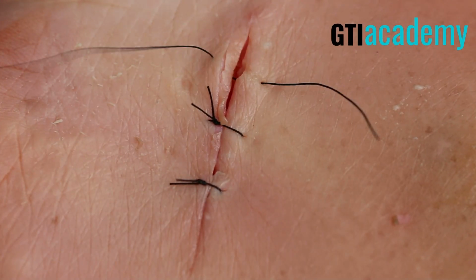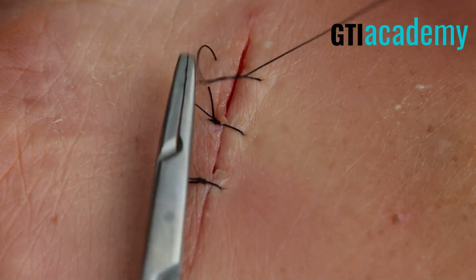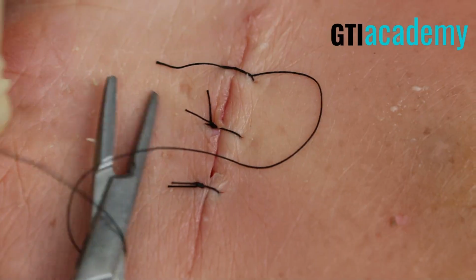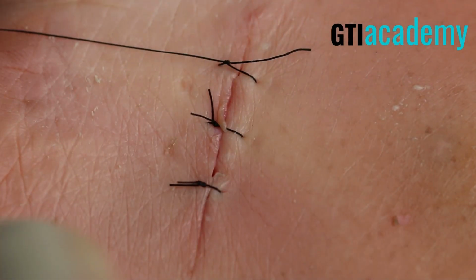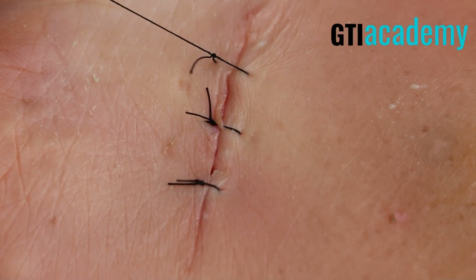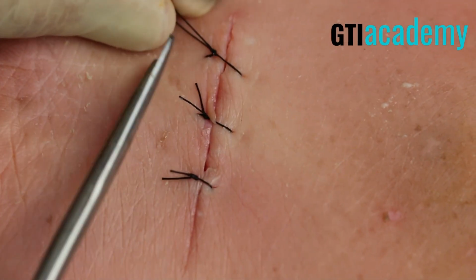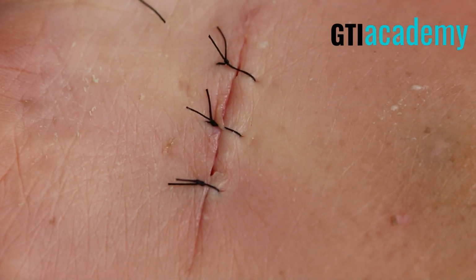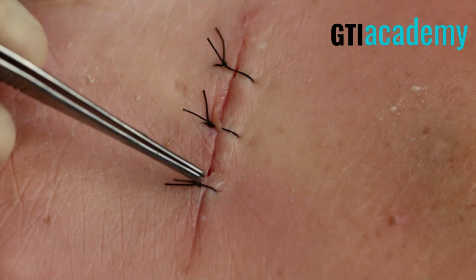Driving, completing the circle. There we go. A suture knot will follow in the surgeon's knot twice here. Then we'll go once and twice, for three for this particular suture. Now notice the wound does look approximated, but I'm going to throw a few more here to get this tissue a little closer.